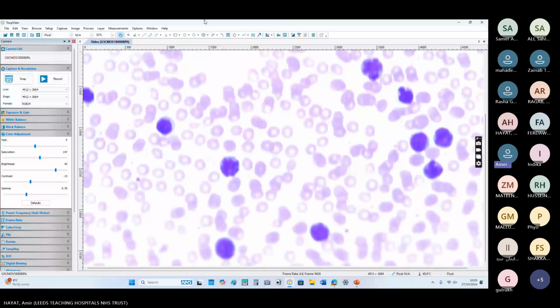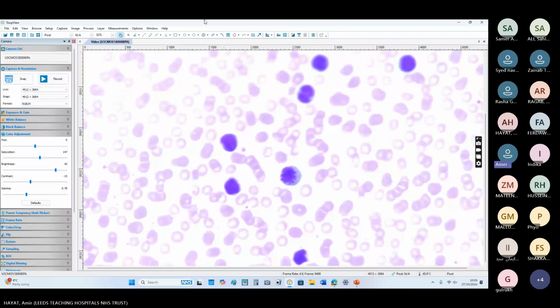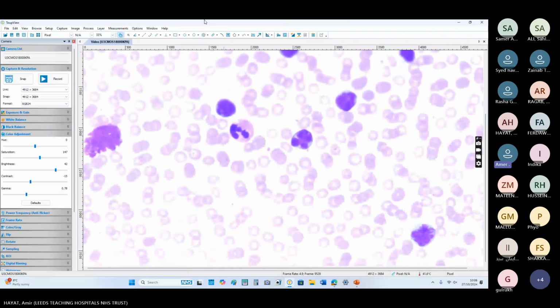If they have given you flow cytometry, it will be very easy to confirm your diagnosis. If not, then you have to suggest it. There are many clover leaf like cells, but this is not ATLL, this is CLL, chronic lymphocytic leukemia.